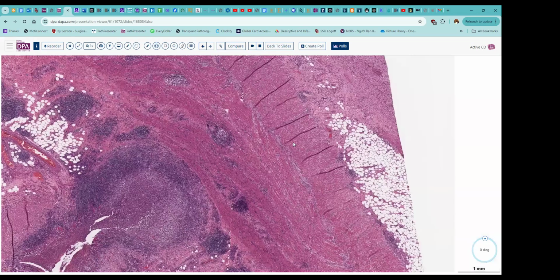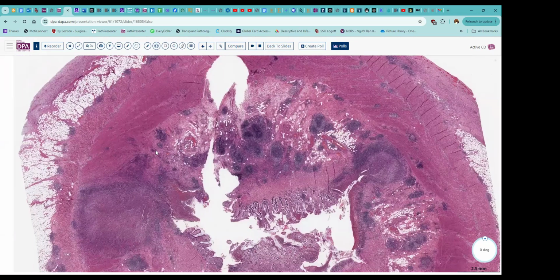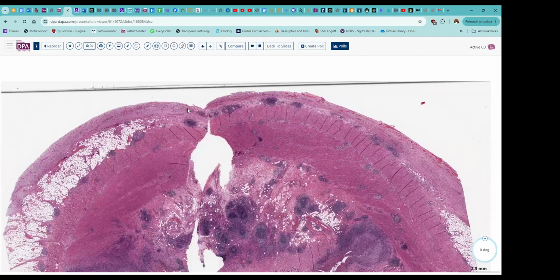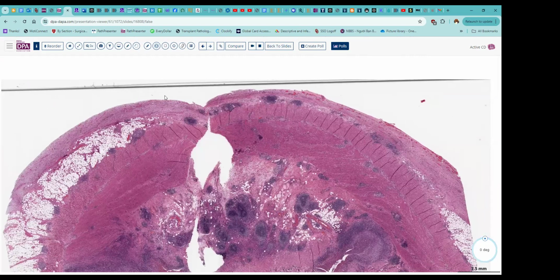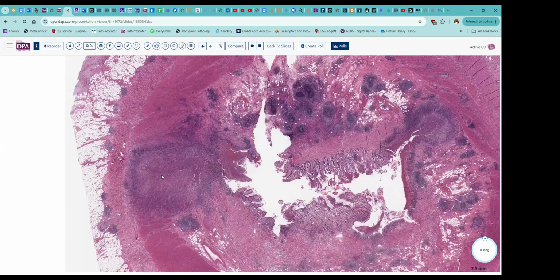The other feature, I think, just to recall, that helps to promote the formation of fistula is the adventitial inflammation. So if you get the adventitial inflammation forming a little bit of stickiness here, that can lead to fibrous adhesions between loops of bowel. That changes the motility and then may lead to further possibility for fissuring ulceration, and the fissuring ulceration with connectivity to an adjacent loop of bowel, then of course can lead to the presence of a fistula.